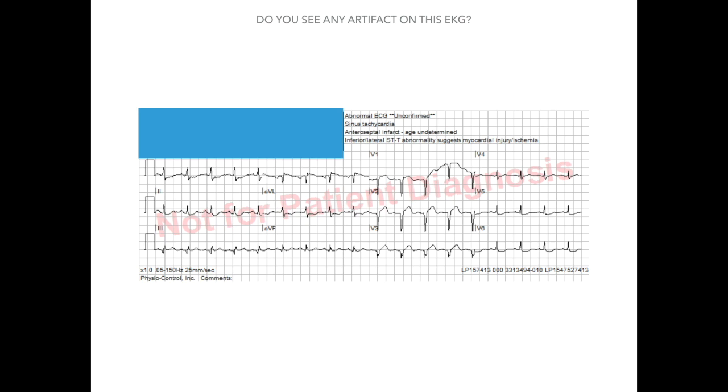So if you look at each lead and you're not sure, then I want you to come to me or talk to your paramedic partner and ask them to show you what a clean EKG looks like.